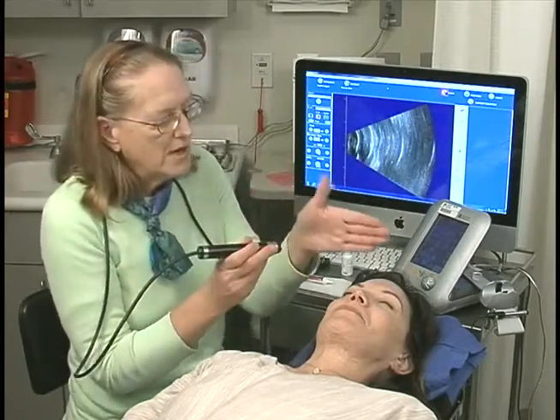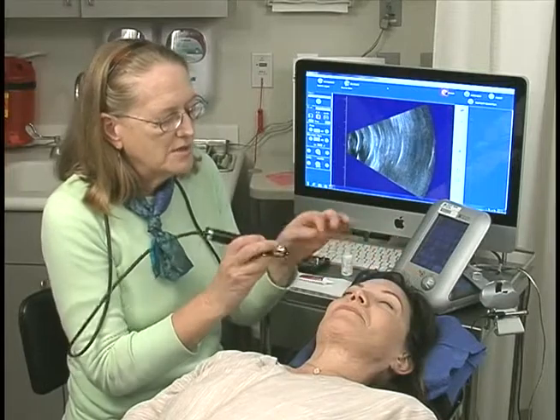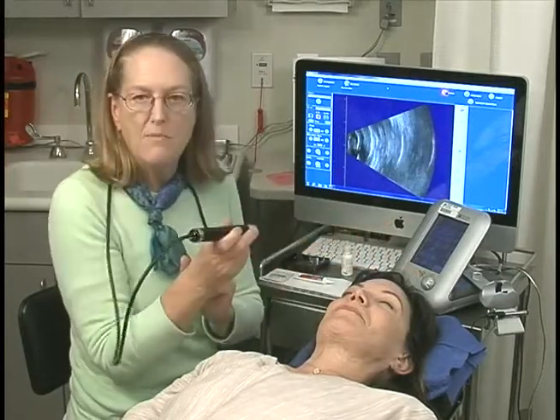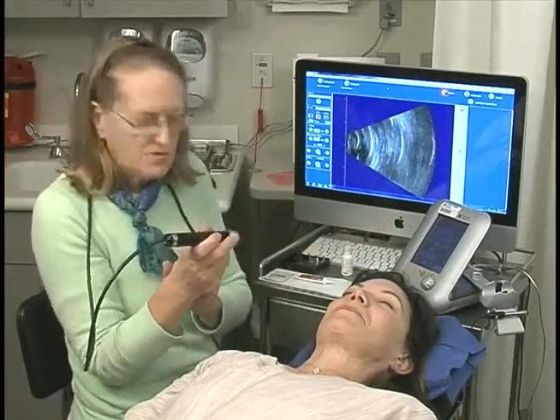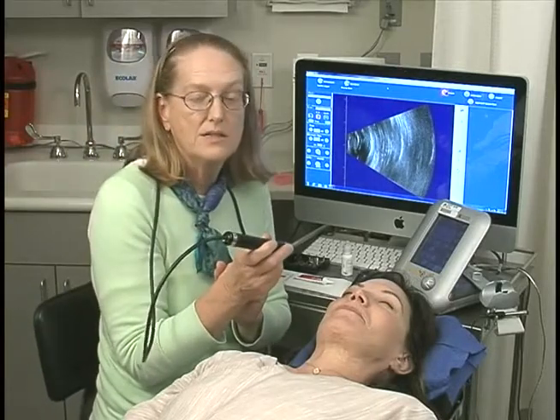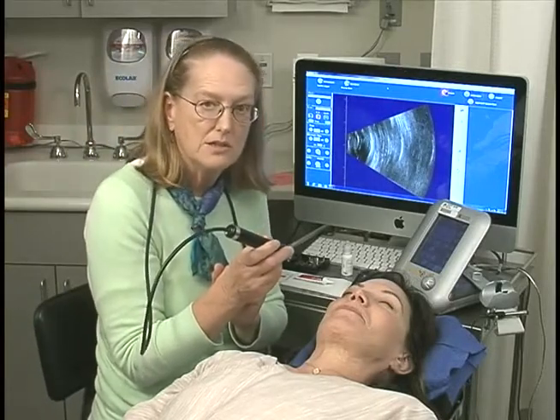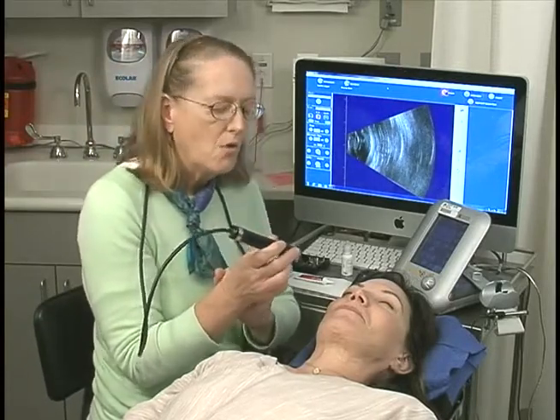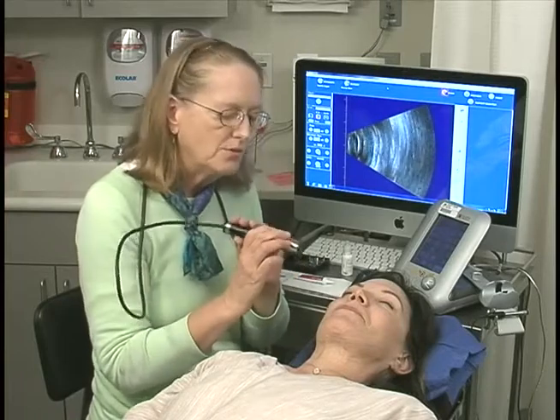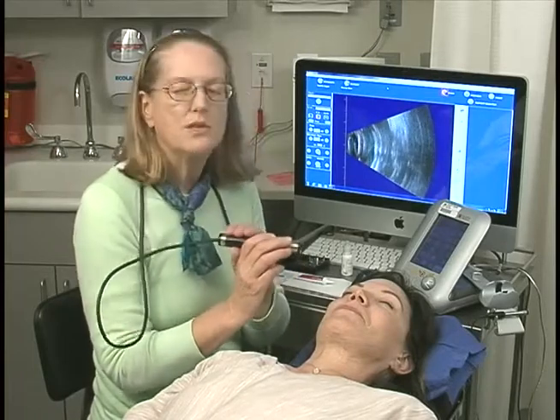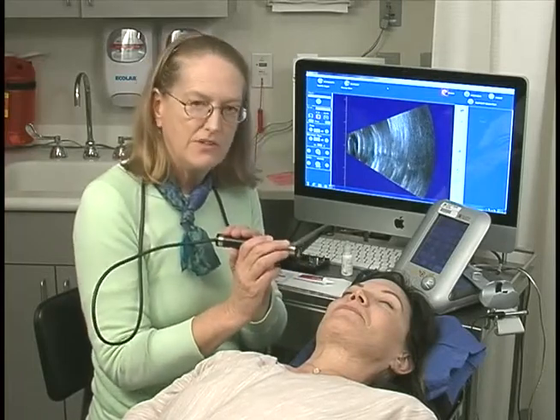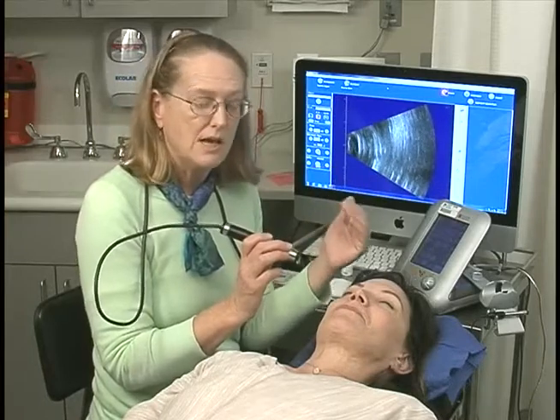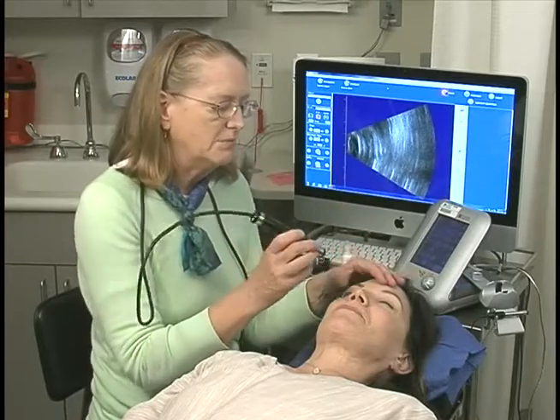Because when I go horizontally — nasal, temporal — I will at least have the macula in this view. Although I would never make a clinical decision about the macula or the retina from an axial view, because when the lens is visible in our B scan, I don't trust the echoes from the retina completely.